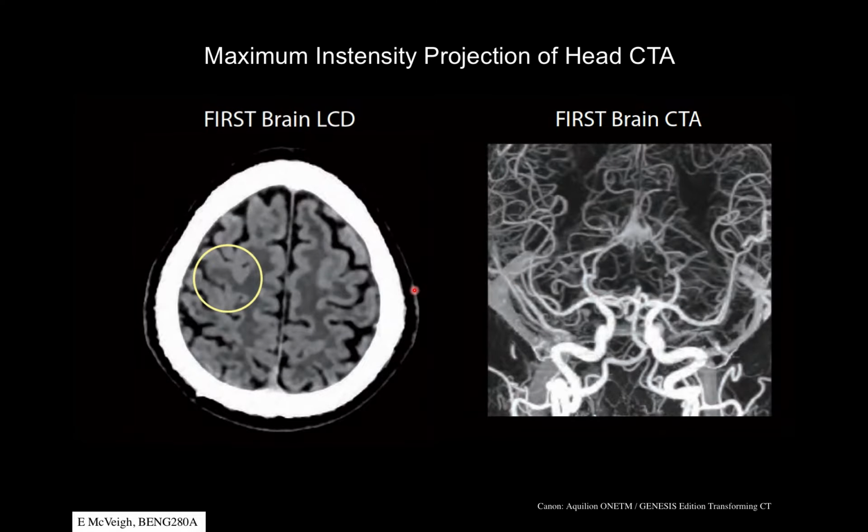So state-of-the-art CT images are pretty outstanding. These are recent images of a human brain with CT. Imaging the brain with X-rays is a little difficult because you have a bony skull around the entire brain, and so getting X-rays through the skull is kind of difficult. It was a major challenge in X-ray radiography for years and years. But you can see very nice soft tissue contrast now with CT.